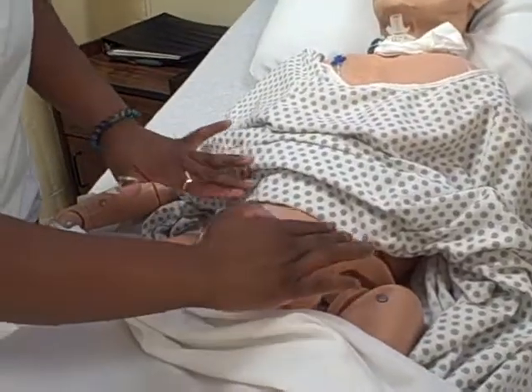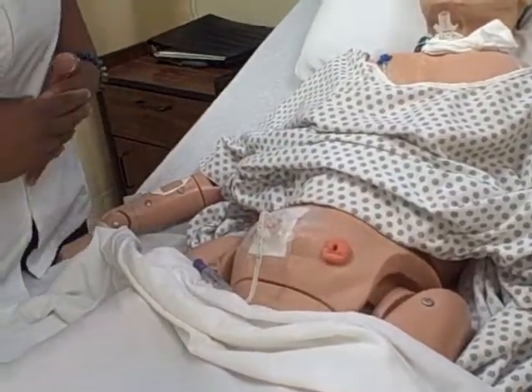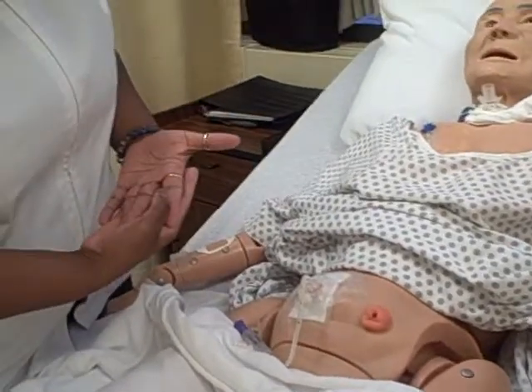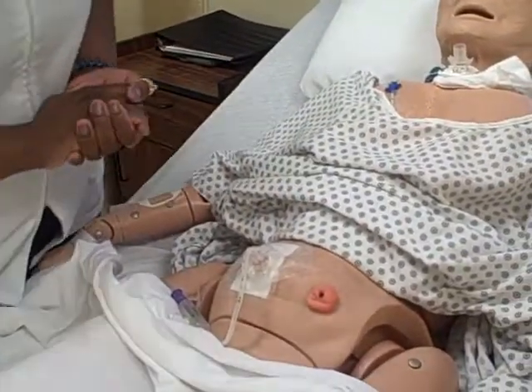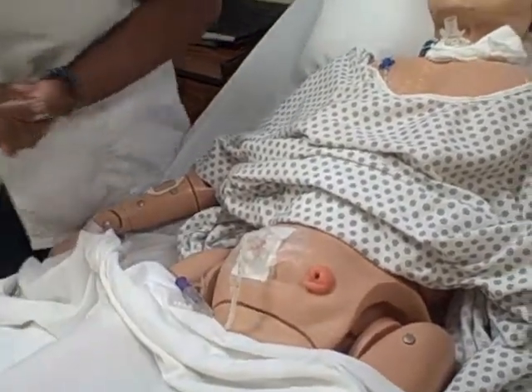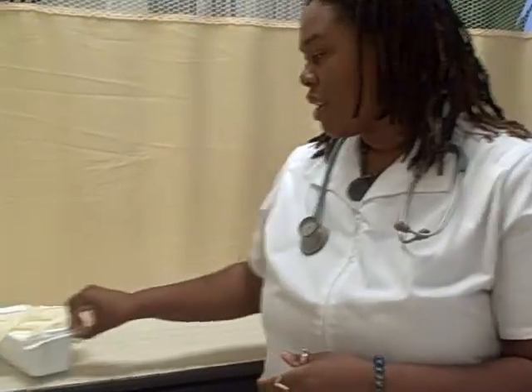I want to ask the patient if they're experiencing any abdominal discomfort, any nausea. The patient said no, and we're ready to proceed. So I want to wash my hands and don my clean gloves.